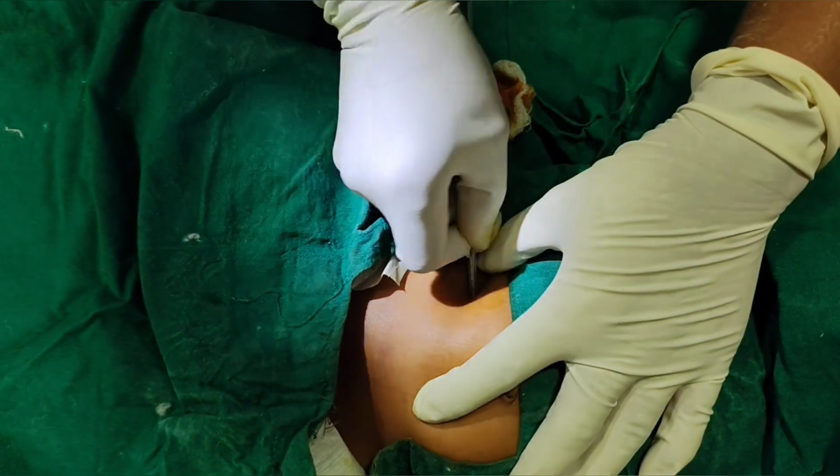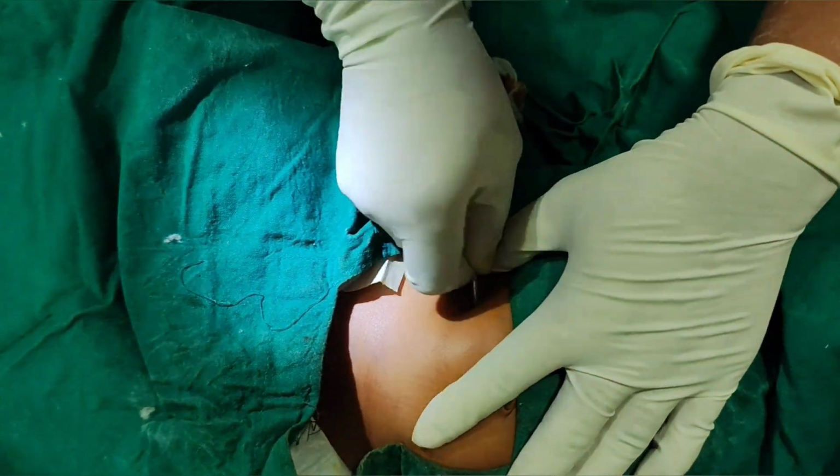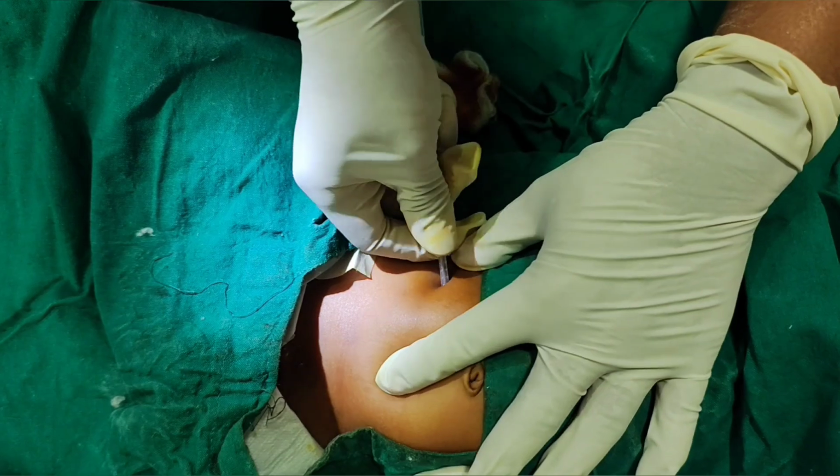Now this trocar cannula is inserted into the skin puncture site and it is passed through the skin and underlying fascia.